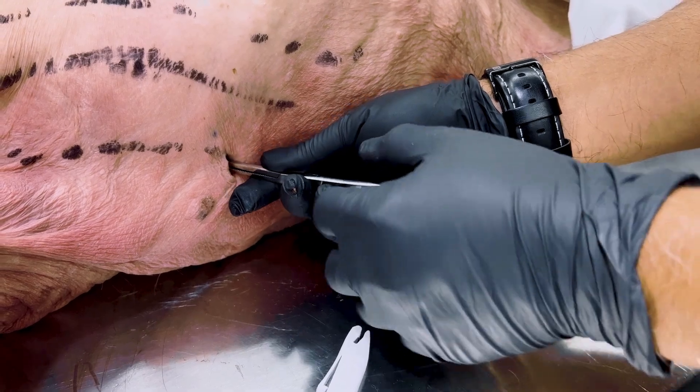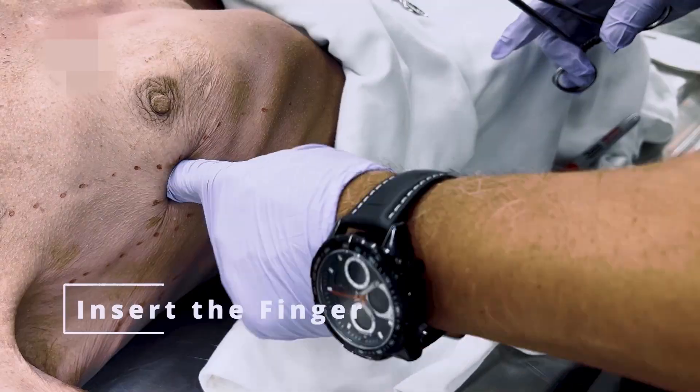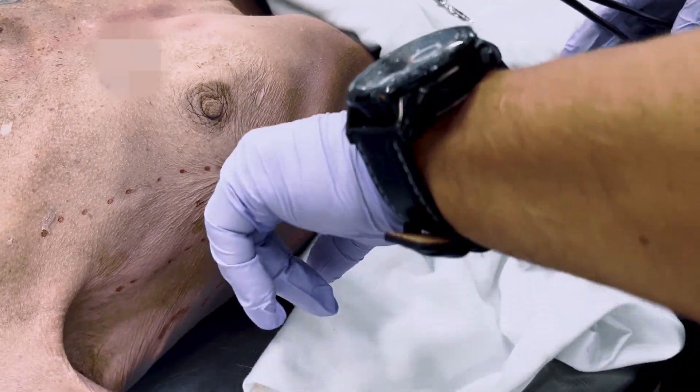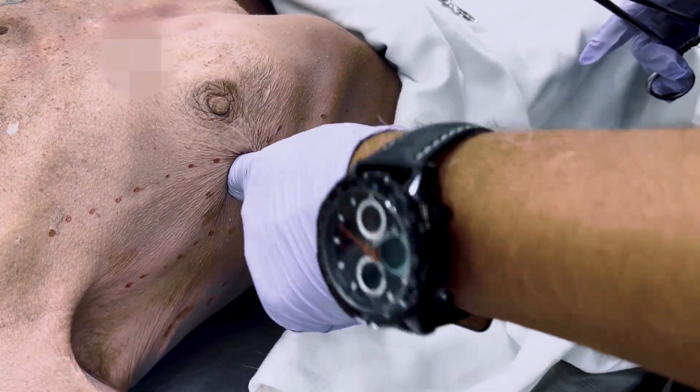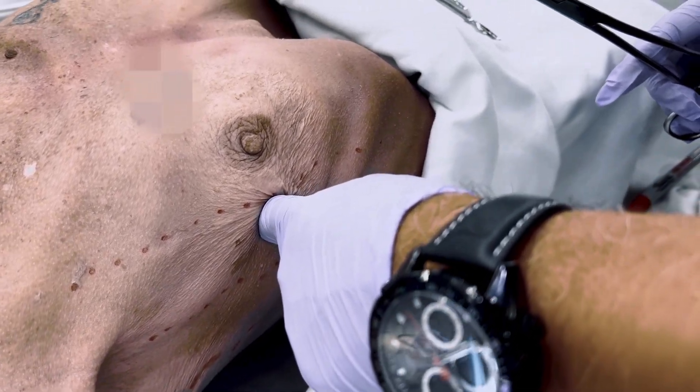Close the forceps and use them as an introducer. Guide your index finger down the top of the forceps and place it into the pleural cavity. Palpate for the diaphragm, lung, and separate away any adhesions. Be careful to avoid lacerating your finger on fractured ribs.